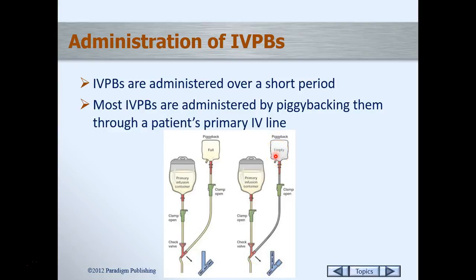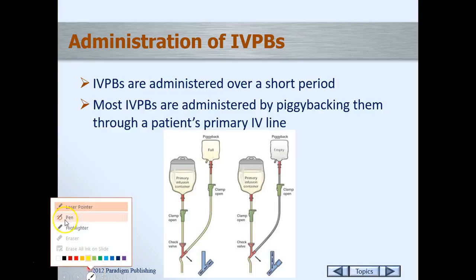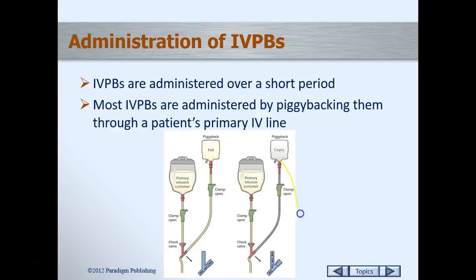So what the previous slide was talking about was flushing this catheter on the IV port of the Y site with the original solution. So this bag would be moved down lower than, there we go. It would be moved down this way so that it would be below that line, and then the fluid would flow back through this port, flush the line, we lift it up, it flushes back out, and then this line can be detached and the primary infusion would be left to run.